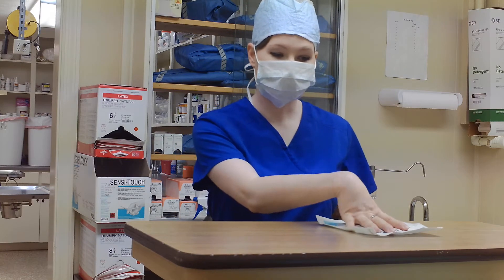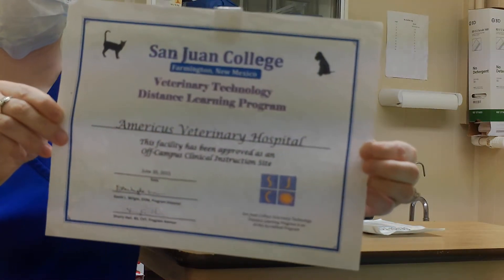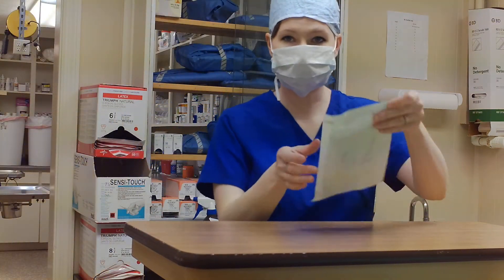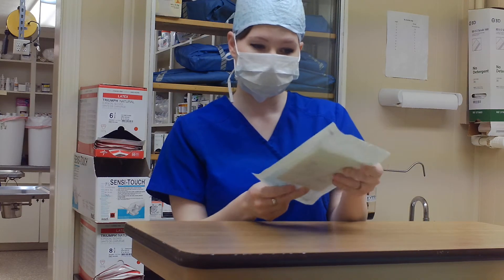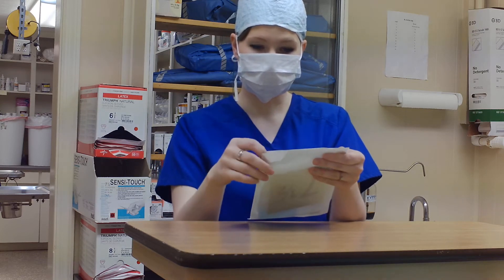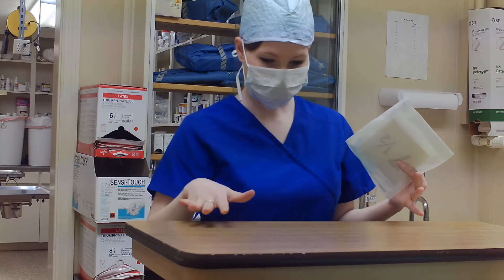This is Megan performing setting up sterile gloves for sterile personnel. This is my OCCI certificate. So essentially what you do is you want to select the appropriate size gloves for the appropriate doctor. This particular doctor wears a 7½ pair of gloves. So what I'm going to do is open up the doctor's gloves and show you how we would prepare it.